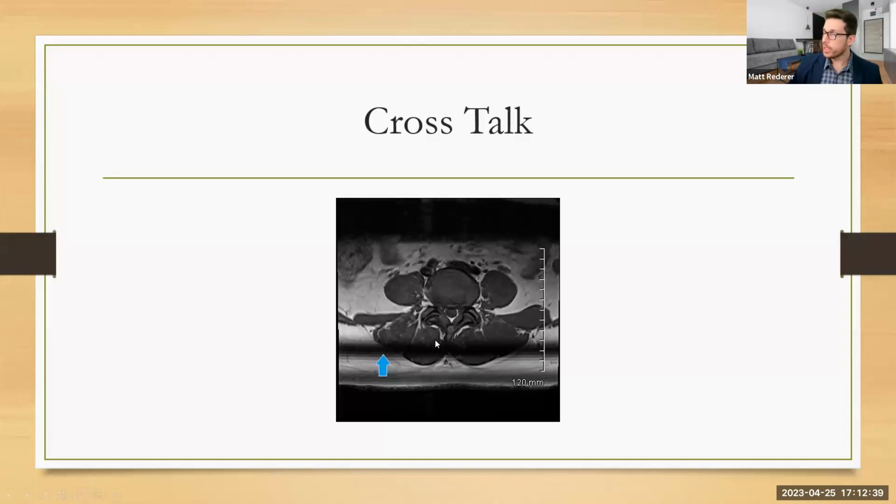Yep, you're welcome. This one here is caused when we have overlapping slices. So if we were to, I'm going to just quickly draw a lumbar spine. All right. And if I'm taking slices through it, these disc spaces here, some of these slices may overlap.